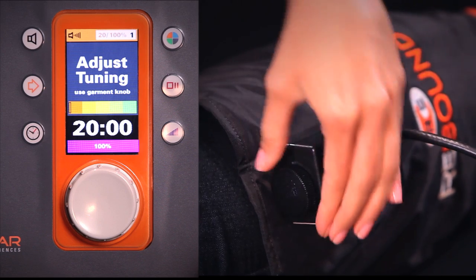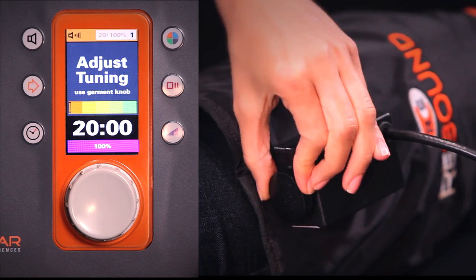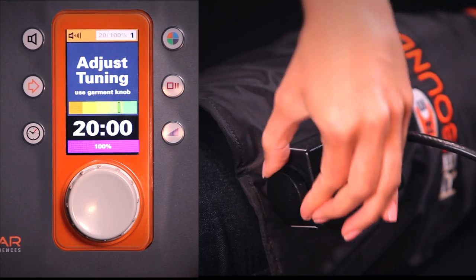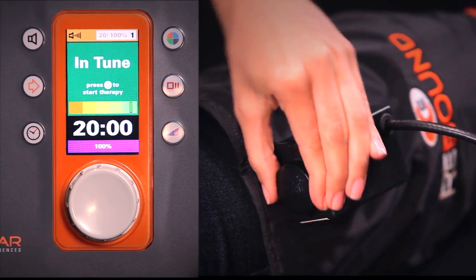So the best option is to pick a direction, right or left, and start turning it until the garment is in tune or the knob stops turning. If you get to the point where the knob won't turn anymore, start turning it in the opposite direction until it is in tune. Once the screen displays in tune, continue to turn the knob until the indicator bar is as far right as possible.